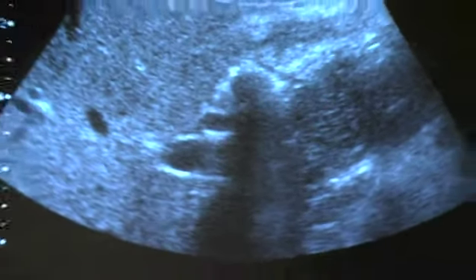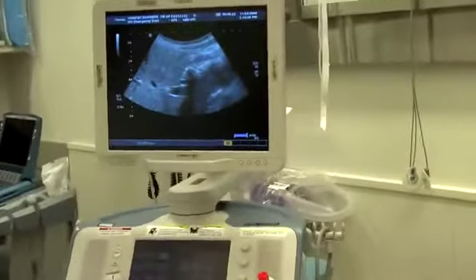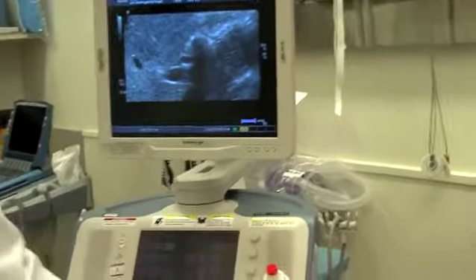Okay. Do you want me to show you how to measure this real quick? Yeah, I think I discussed it pretty well. The normal size is. Oh, he's going to zoom in on it. So you hit zoom, you hit the depth button, which is the same as the zoom button. You just push the button in. Oh crap.